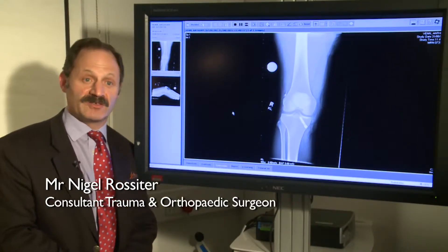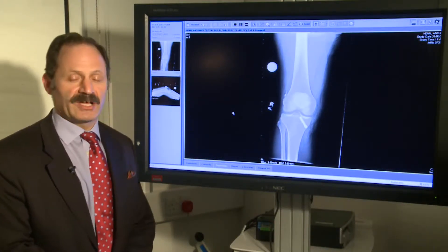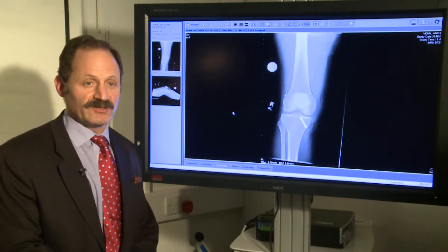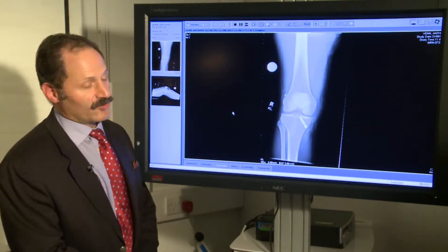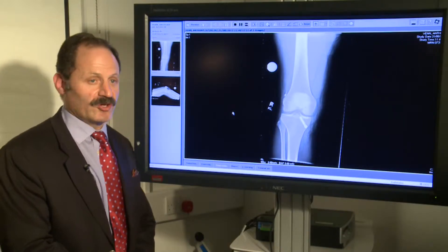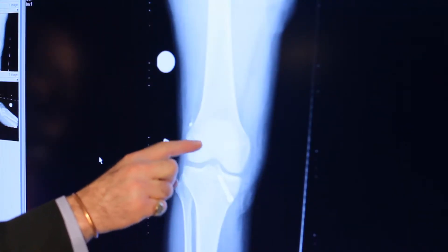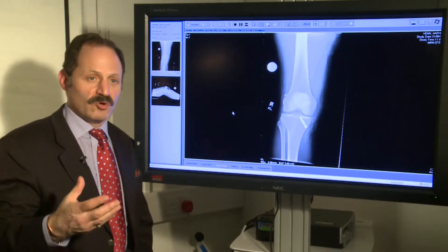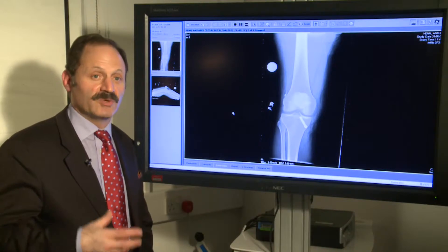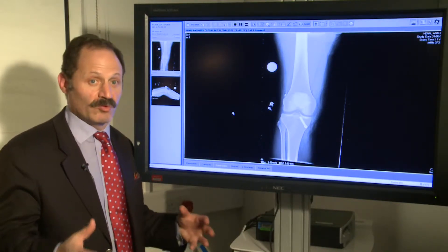This is an ACL reconstruction that's been done with a hamstring tendon. What has happened is that tunnels have been drilled in the knee to make a new ligament. Through the arthroscope, we drill a tunnel in the centre of the knee joint through the thigh bone towards the outside. Over the years we've become more proficient at putting this in the right position, and we now put this in what's known as the anatomical position — we recreate what was there previously.